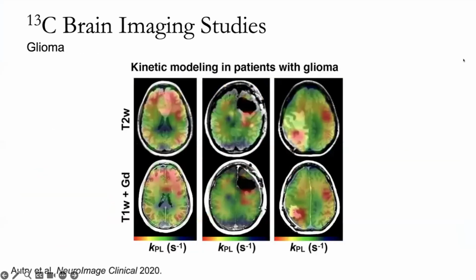And in particular, in the brain, I'm just showing an example figure from Dr. Autry in our group, showing the possible applications in evaluating glioma. This is already fairly old at this point, but we showed some very exciting results.